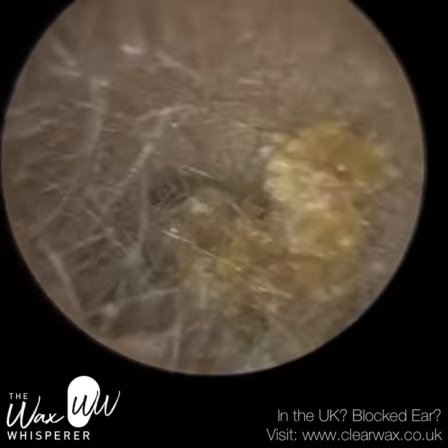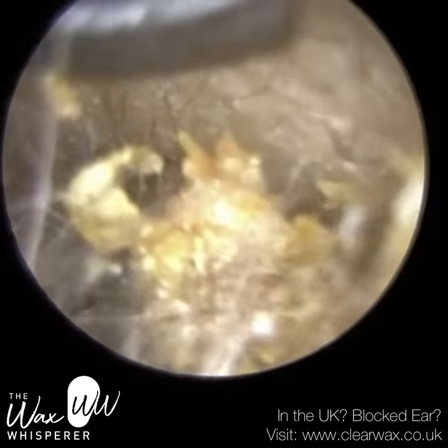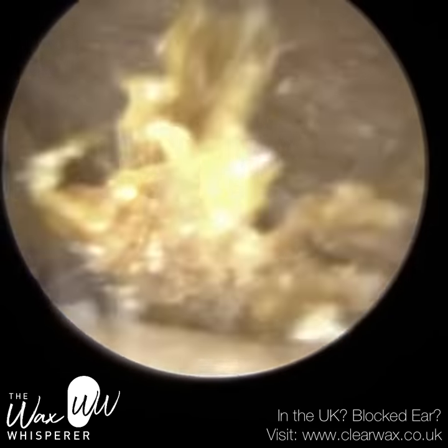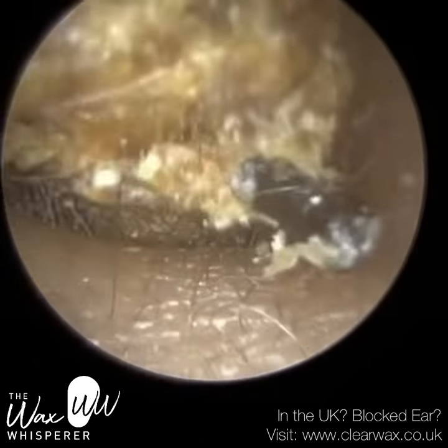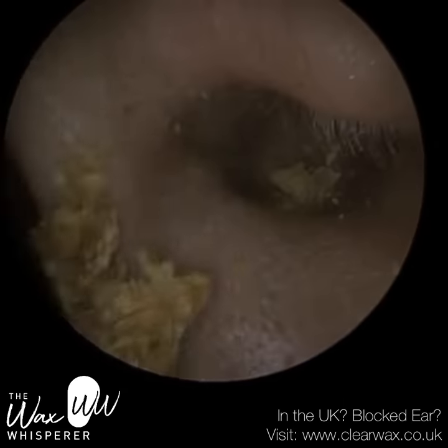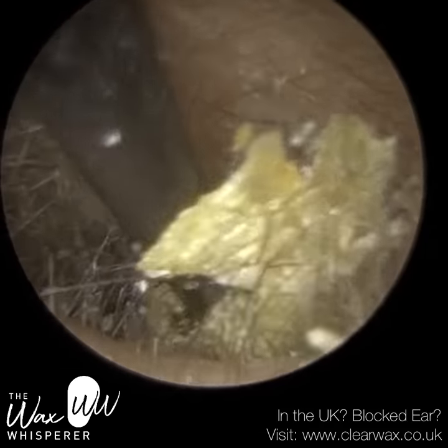This ear is a bit narrower. I'm using the hook to get over and beyond this dry wax and skin. There's a lot more dead skin in this ear than the patient's left side. Slowly but surely we're bringing it out — a quite significant piece came out. As I was bringing it through, some of the tail end of that wax and dead skin plug just broke off. I'm trying to get in and behind the posterior canal wall, managing to glide the hook in behind and slowly come out.